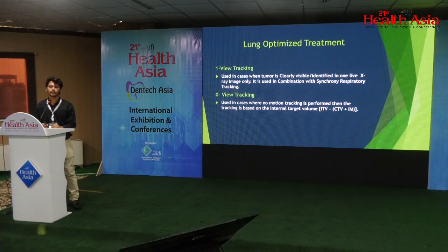In rare cases, we cannot completely visualize the tumor or even target the tumor. So during planning, if we can visualize the tumor in only one X-ray, the physician and the oncologist who are responsible for the contouring and target marking of the tumor volume draw extra target volumes to compensate for this inability to visualize the tumor. And in cases where we cannot visualize the tumor in any of the X-ray images, further extra margins are given along the respiration cycle.